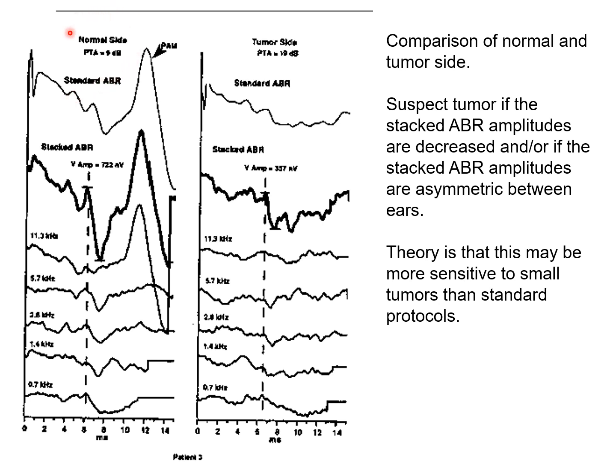On the left-hand side, we have the normal side. Here we use standard ABR, click evoked only. And we have the ABR wave here. The ABR wave amplitude is this.